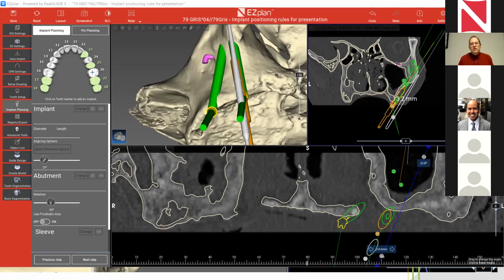Well, you could, because with drill number one, you're starting with the dimension of 2 millimeters. You can go even higher in the speed. But I'm not sure that it's a matter of speed. Maybe we talk afterwards and you explain to me exactly what happened. But anyway, you asked me, what you wrote here is to have the drills less aggressive.